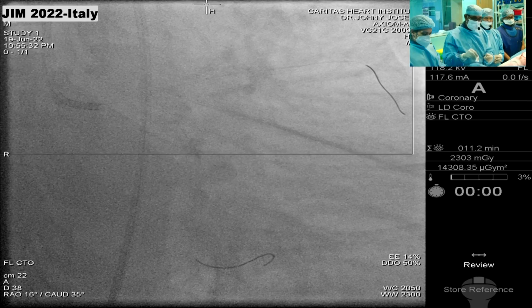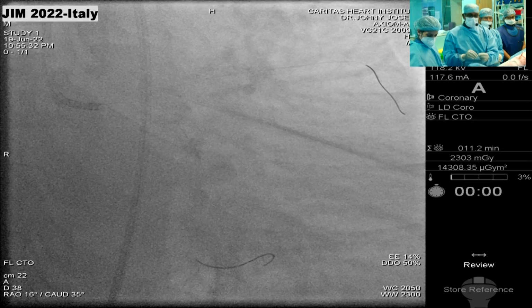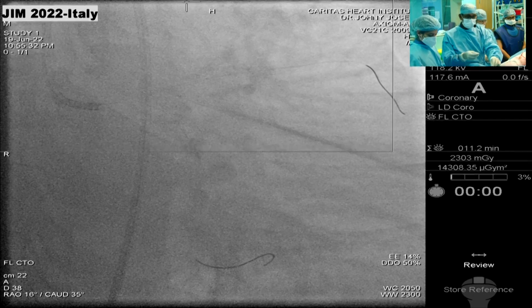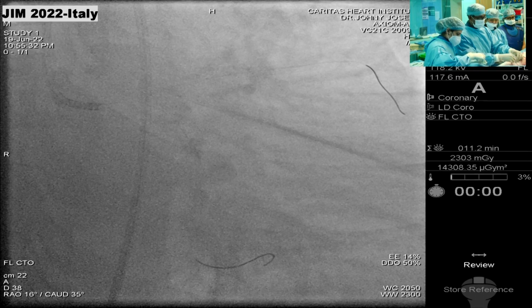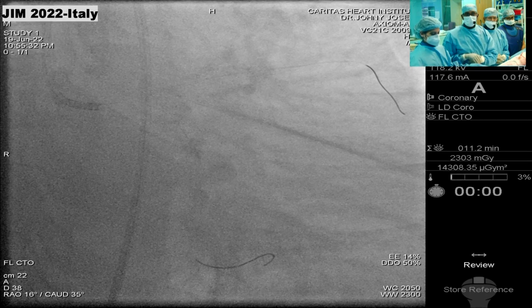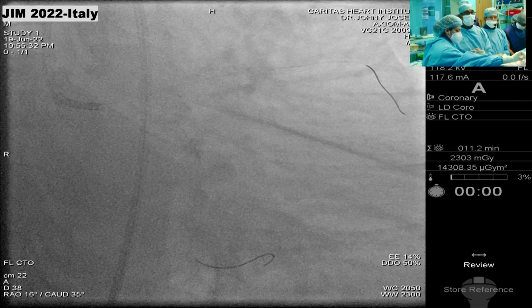So what was the diameter of the balloon that was used initially? Well, let's hold on for a moment because I have some more comments. Carlo, at least I learned a lot from the OCT. I was suspecting there would be a high degree of calcium at the culprit occlusion, and angiographically, fluoroscopically it looked severe. I agree with the interpretation of the OCT. I'm just saying I was surprised. Otherwise, I would say there's tremendous calcium in that area, which apparently is not that much. Weren't you surprised too? Yes, I am.